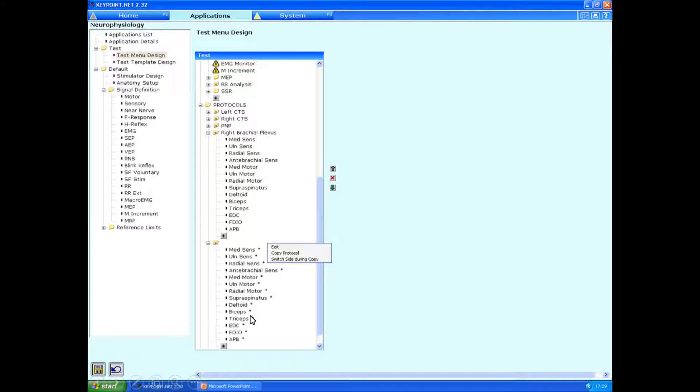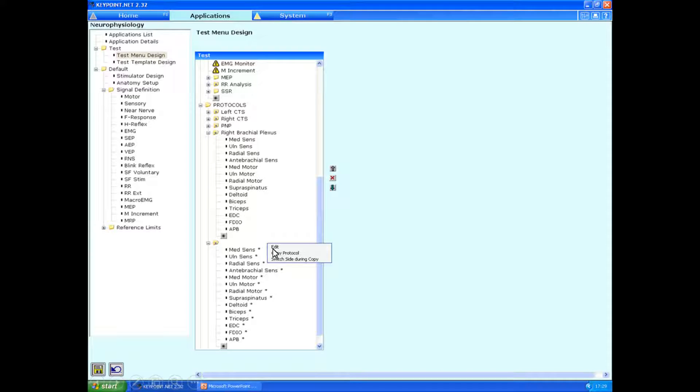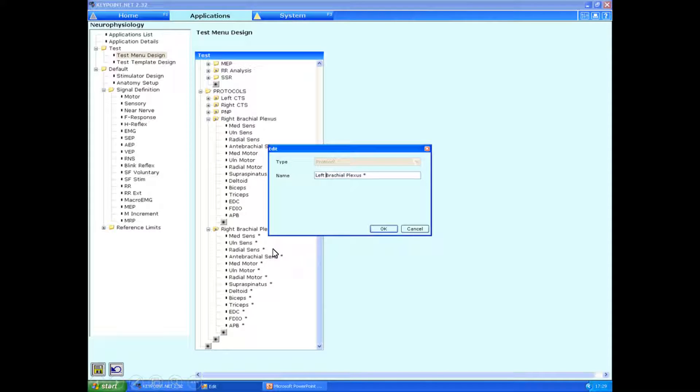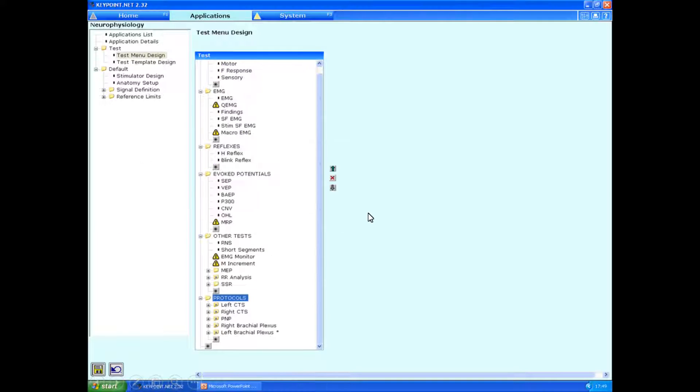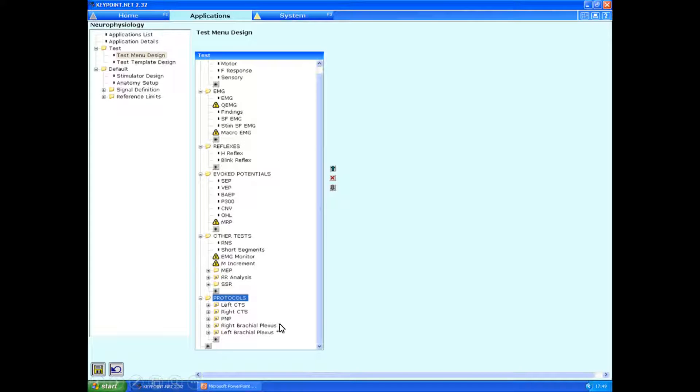We still need to change the title of the protocol by clicking on right clicking and then edit. And then we just type in left brachial plexus. And that's it. So now we have very nicely right brachial plexus, left brachial plexus. And on this particular set of protocols, that's all ready and good to go.